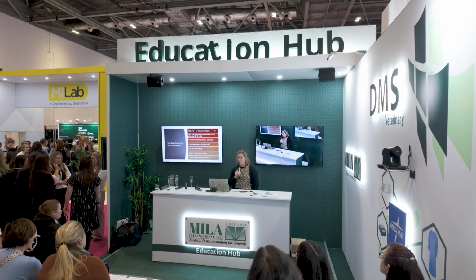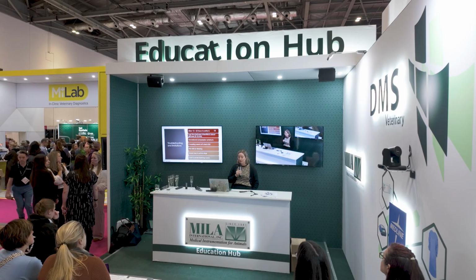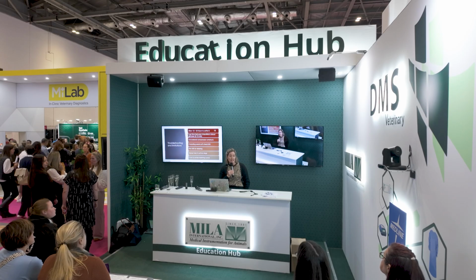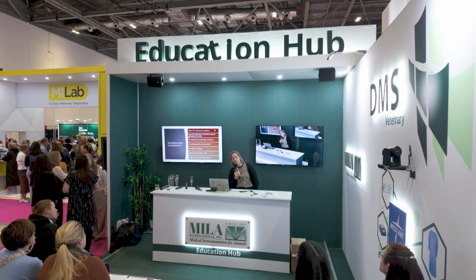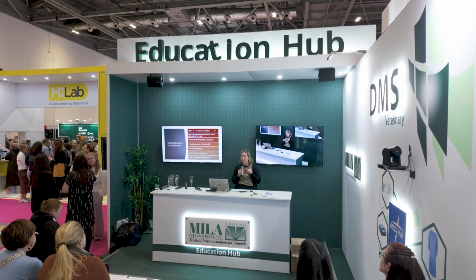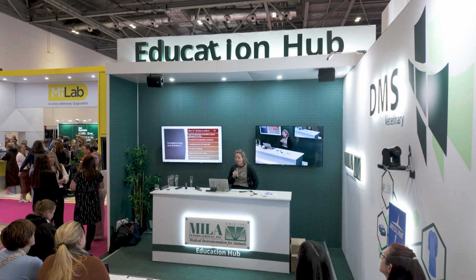And again, as we said, bringing owners up to speed in terms of the cost and the learning curve. These sensors come in at approximately £60, but if that's saving that owner from making a trip into the vet or having to do regular blood glucoses, which is very stressful, then certainly if it was me as an owner, that would outweigh that cost for me. So it's going to come down to that owner.